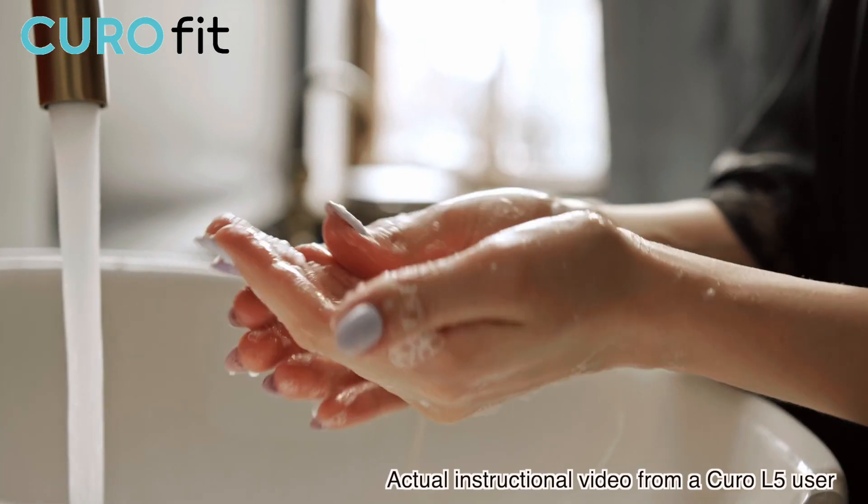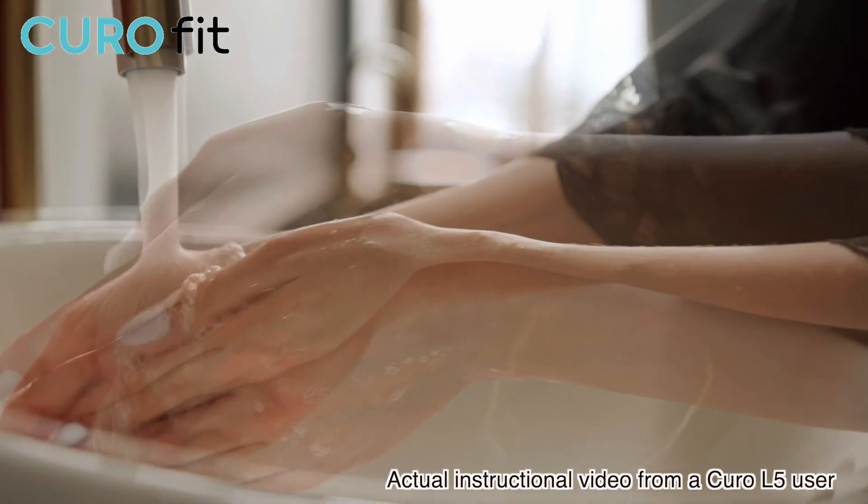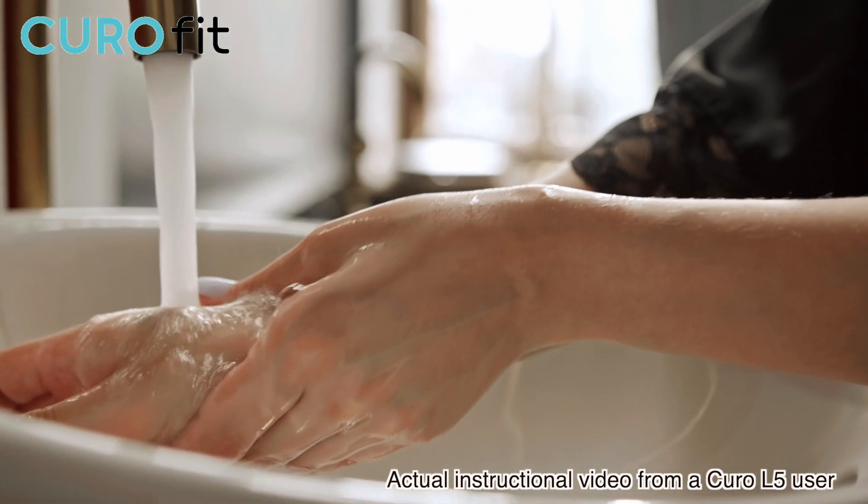When you're ready to perform the test, make sure that you wash your hands with warm water and mild soap and get them as warm as possible.